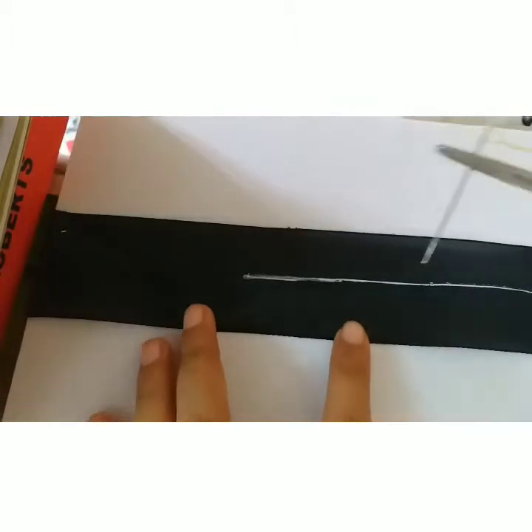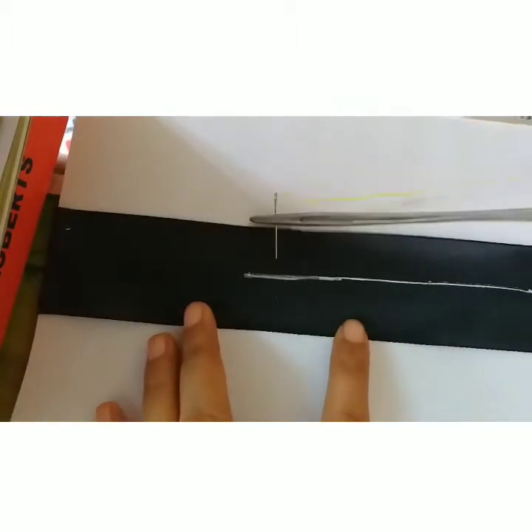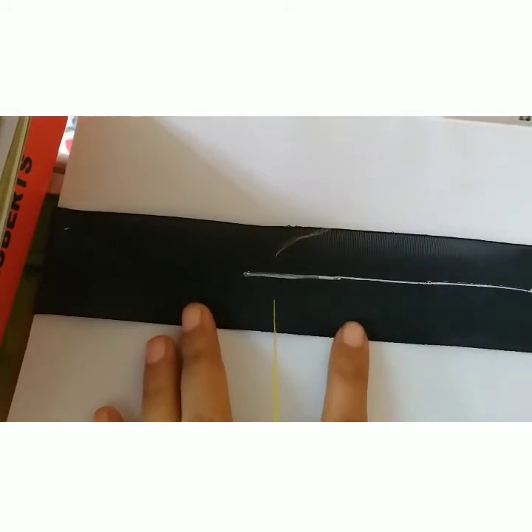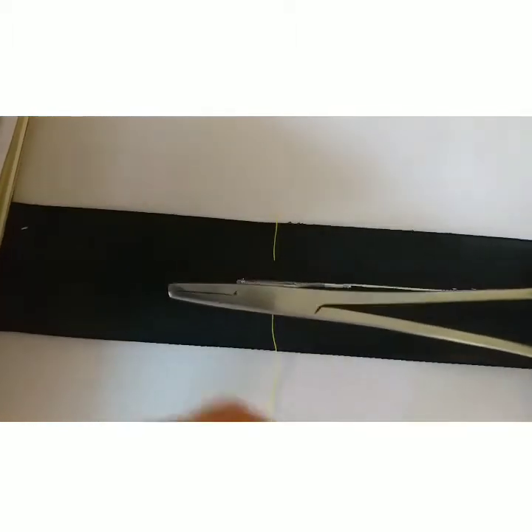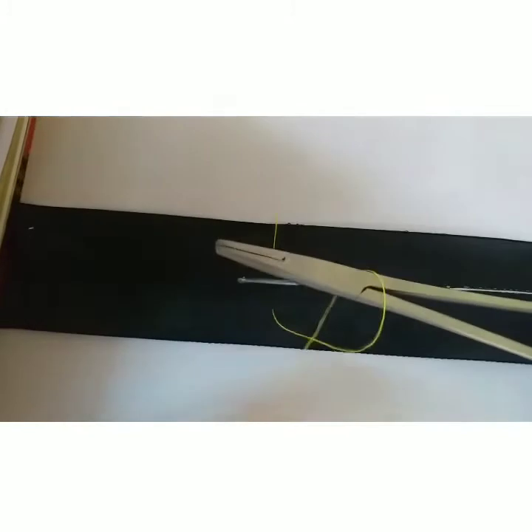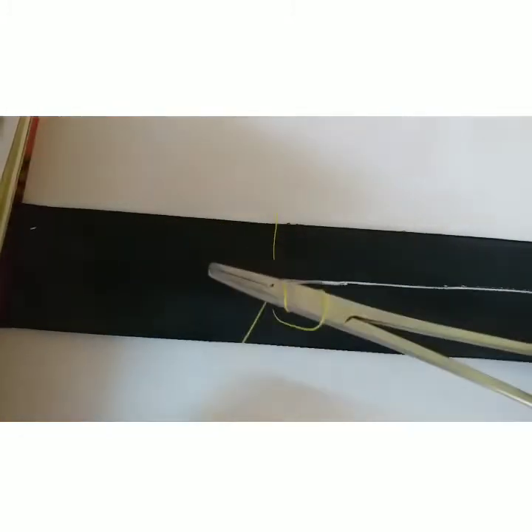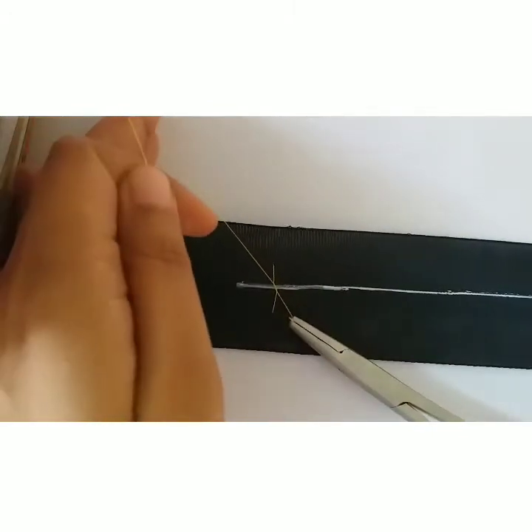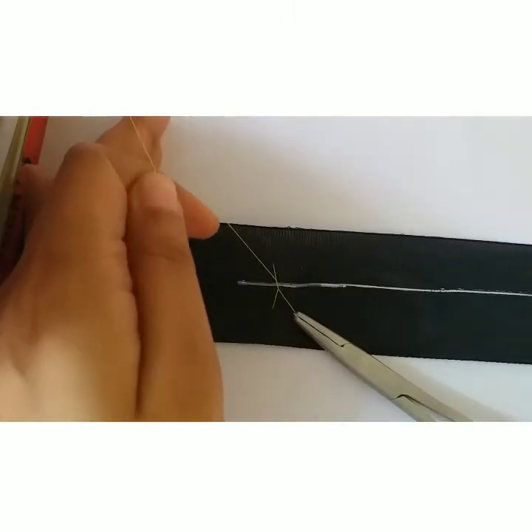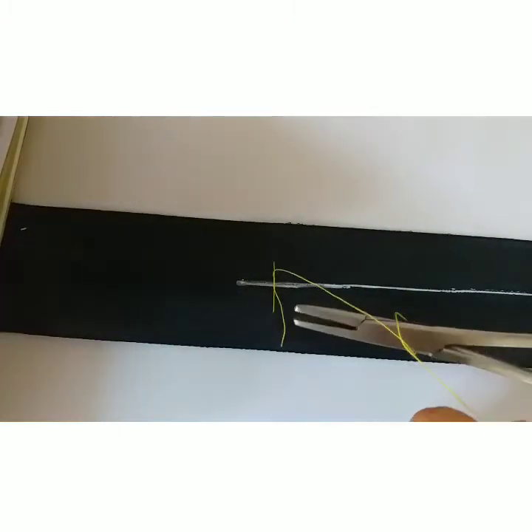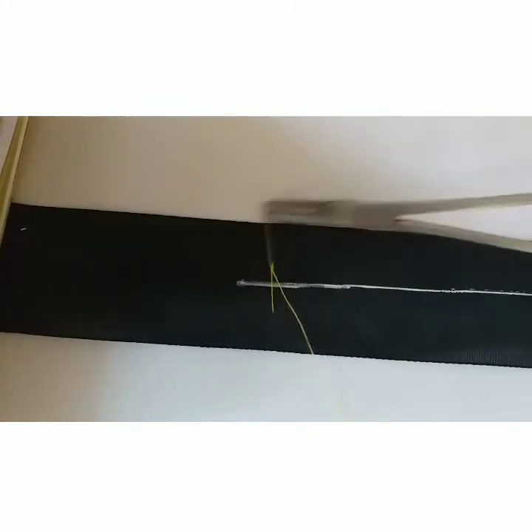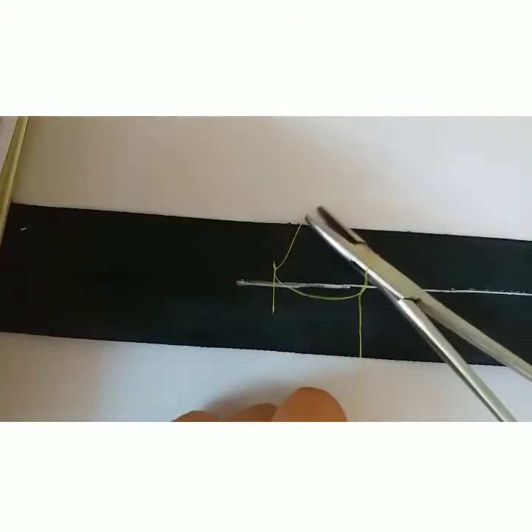Now, suppose the white line is the cut or incision. I will take the needle from one side to the other side. And now I will put the forceps on the incision. I will take the thread around the forceps and pull the right hand to my side. Then I will turn one more turn, and now my right hand will go further. This completes the surgeon knot.